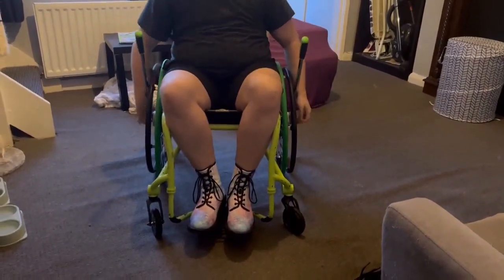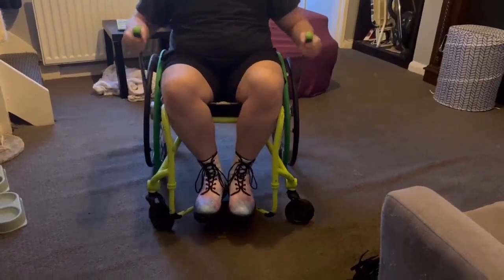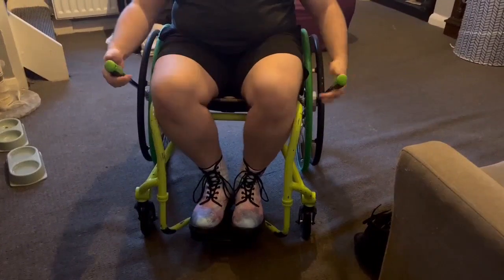Right now I want to go forward. Just move this back to forward. And then to brake, you just pull them in.